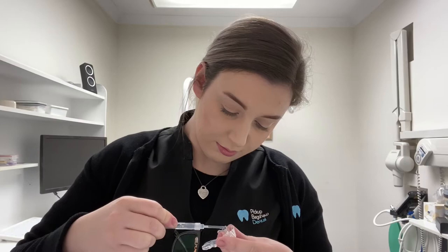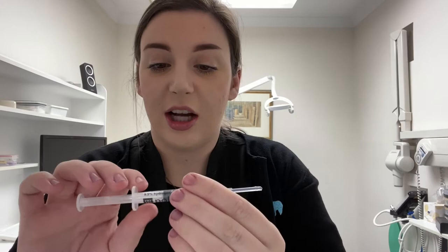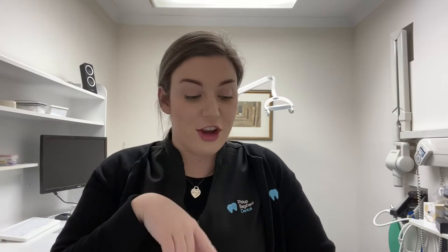I'll pop this in now so you can see. I'm going to do the same for the bottom now. As you can see — excuse the lisping — I only use a little bit, because a little goes a long way. I'm going to sit this on my teeth for 30 minutes, and after that I'm going to show you exactly what to do afterwards.